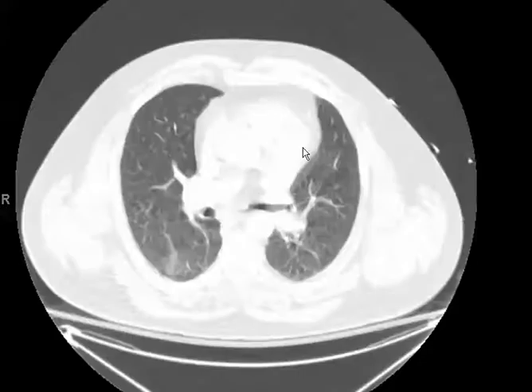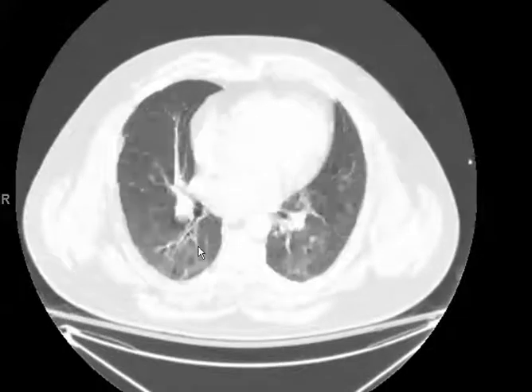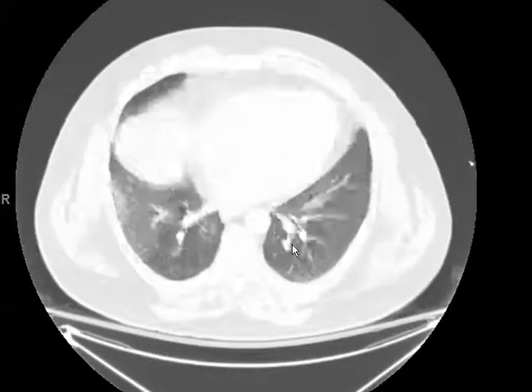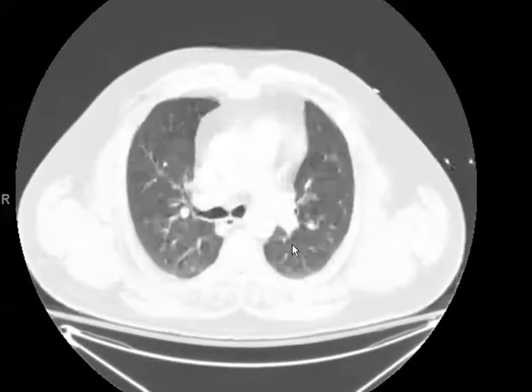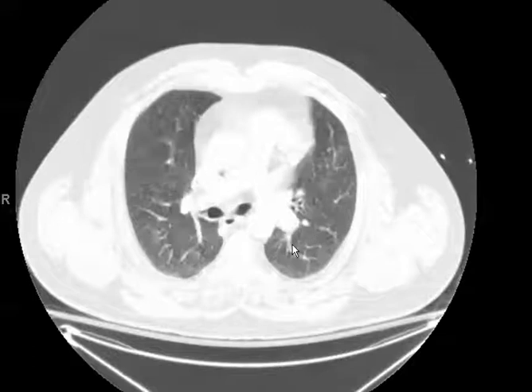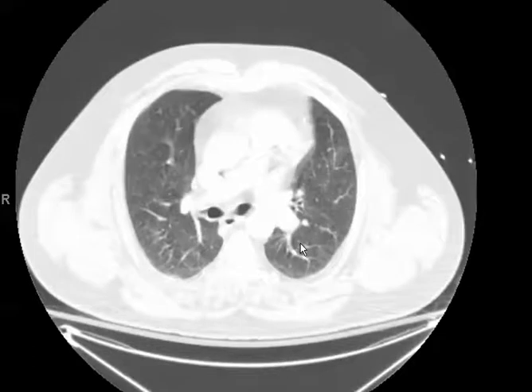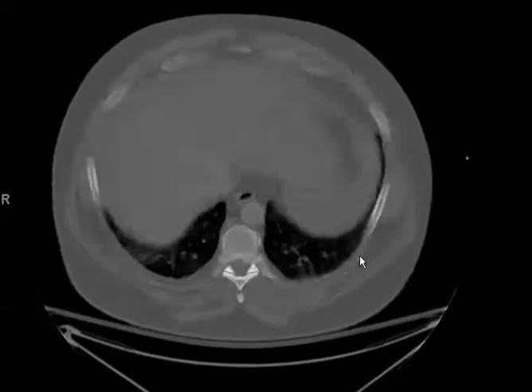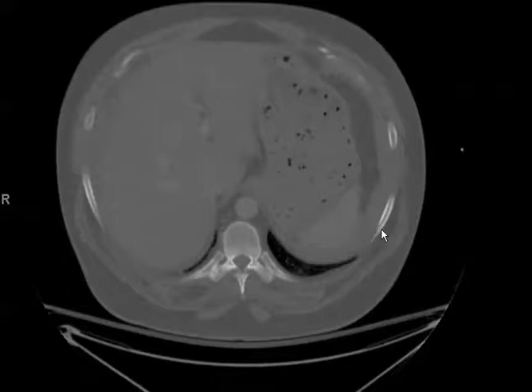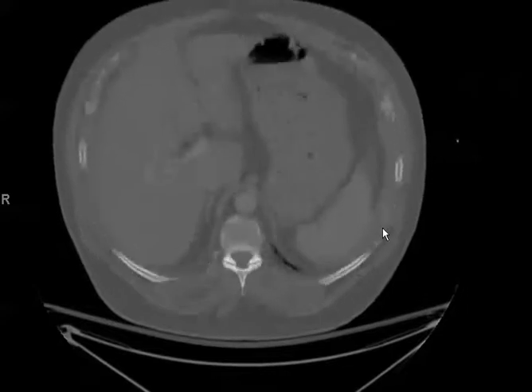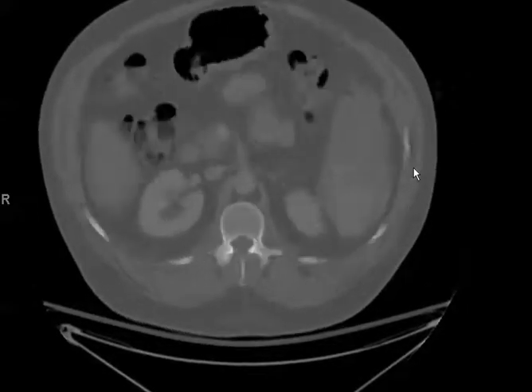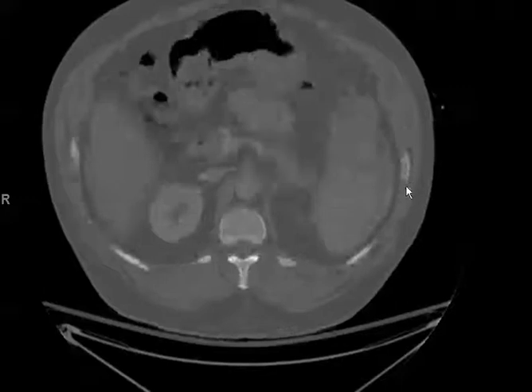If we put this on lung windows, notice already that there is ground glass attenuation at the lung bases, which was felt to reflect pulmonary contusions. No pneumothorax or laceration was seen. If we put this on bone windows, there is an isolated left 10th rib fracture here. No other rib fractures were seen.